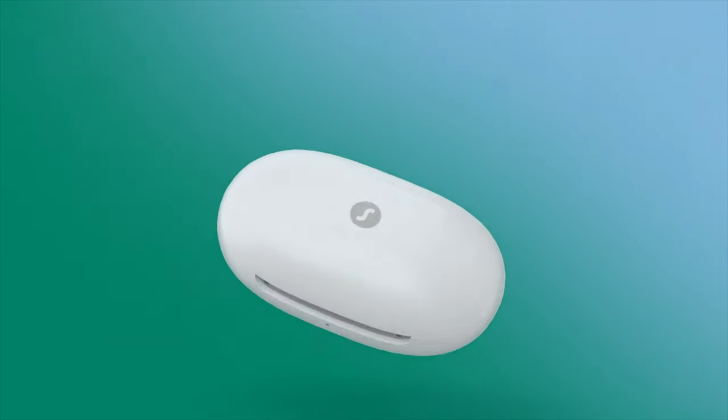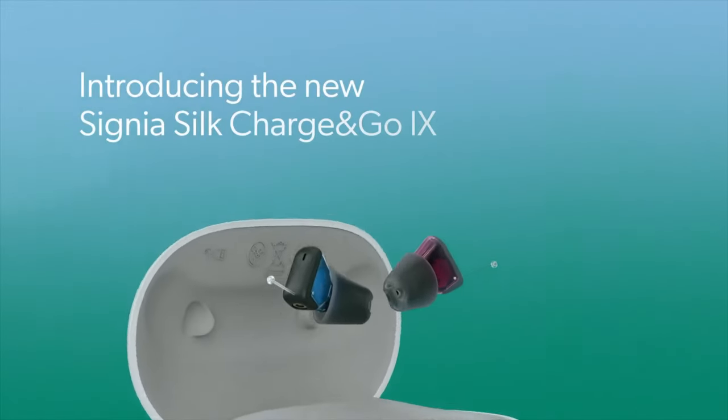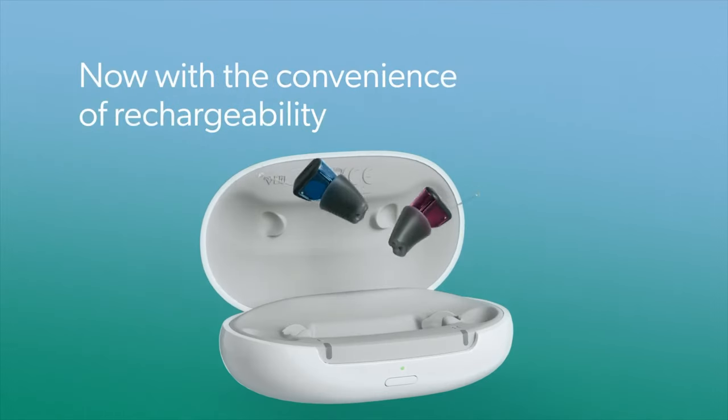On this new iX platform, we will see the Signia Pure Charge & Go iX, which is the rechargeable receiver-in-canal version. The Signia Pure Charge & Go T iX, which has a telecoil, as well as the Silk Charge & Go iX — a rechargeable completely-in-the-canal prescription hearing aid. I do expect Signia to come out with other models on this iX platform, but I don't know when or if they'll ever come out.